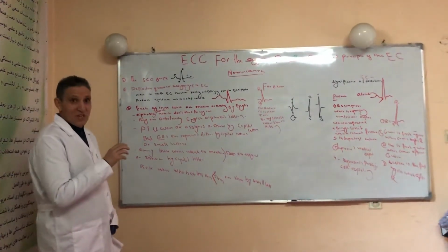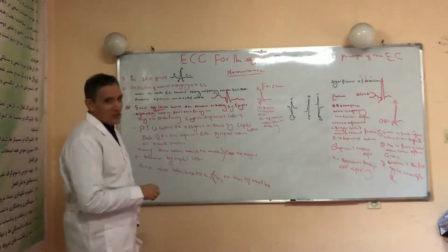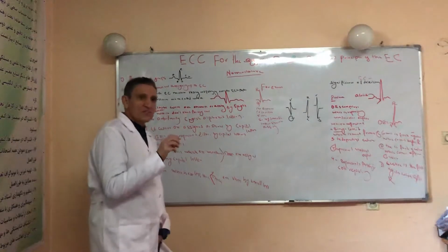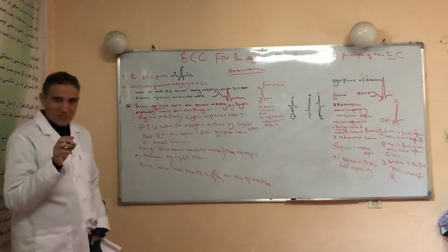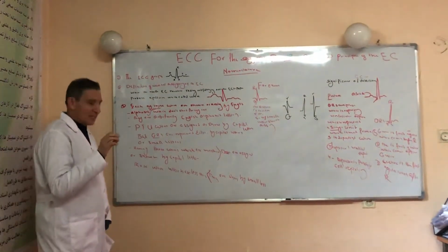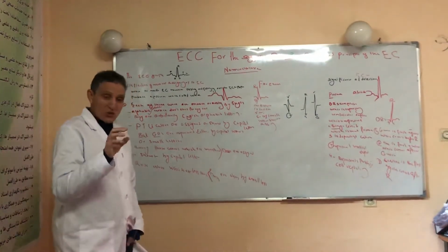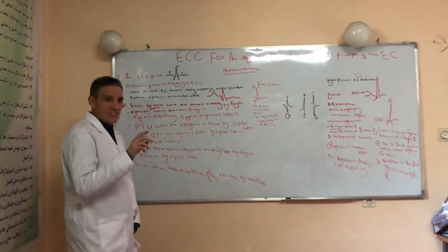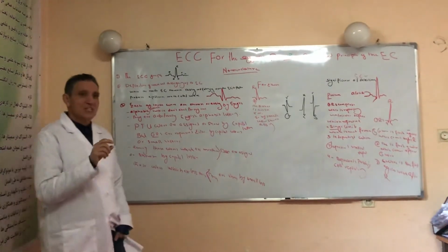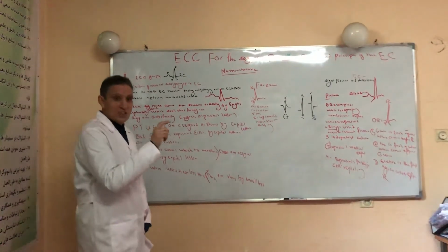It is a little bit tough to know the mechanism by which the QRS complex is produced and assigned. Right now, we will say again, each of these waves is shown by an English alphabet letter, which doesn't stand for anything. They are arbitrary letters. Remember, the P, T, and U waves are always represented by capital letters. The QRS complex can be represented by either capital or small letters.